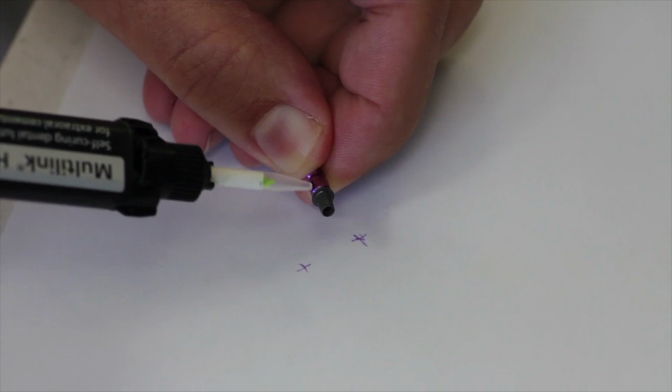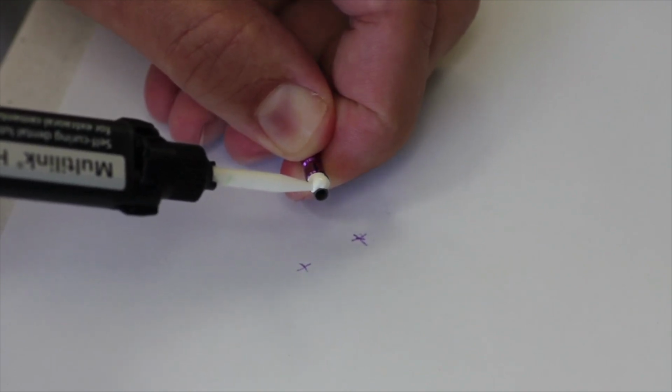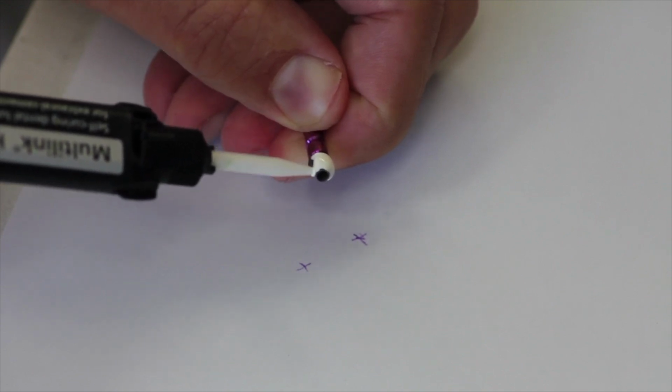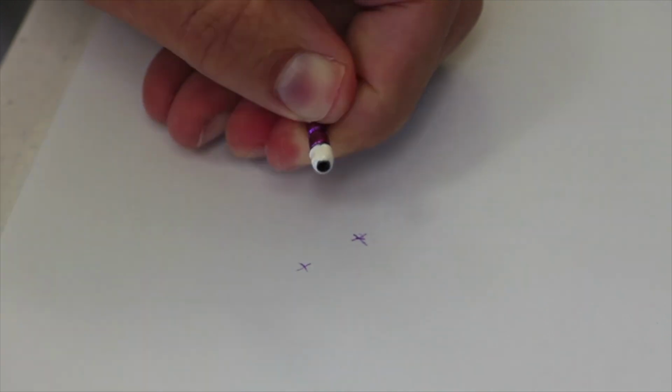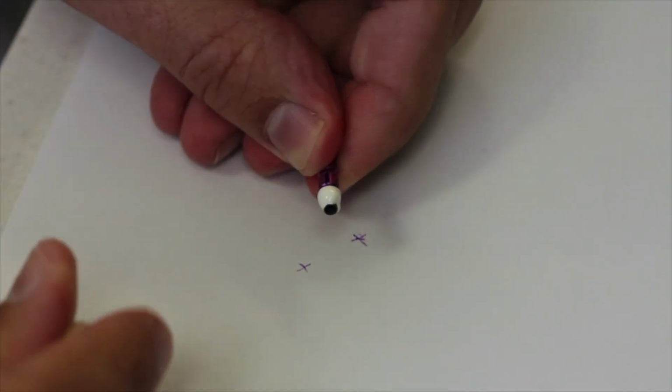We are now ready to place the Multilink Hybrid Abutment directly on the titanium base. Notice I do not have the screw access hole of the titanium base blocked out. By doing this, when I seat the Emax abutment, all the excess will move out of the bottom of the titanium base and not get stuck in the screw access hole.